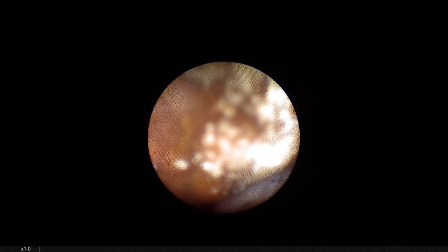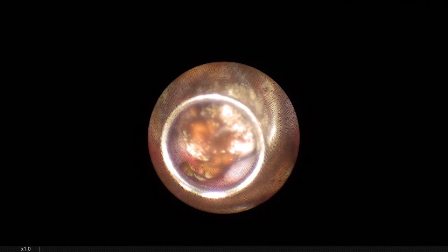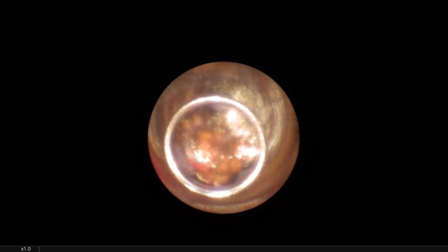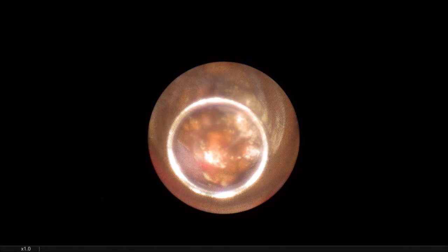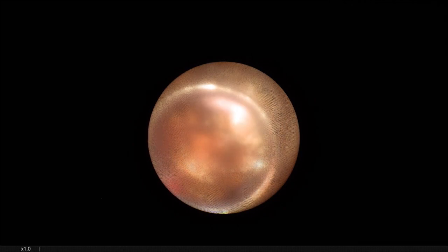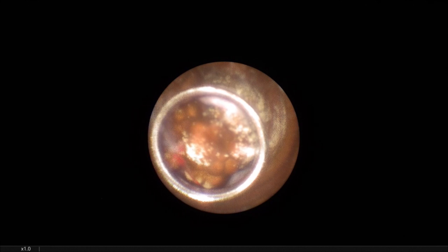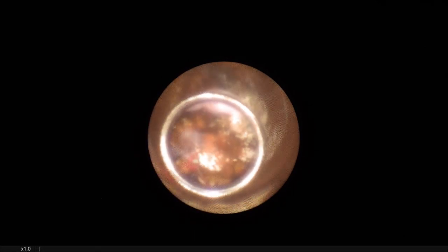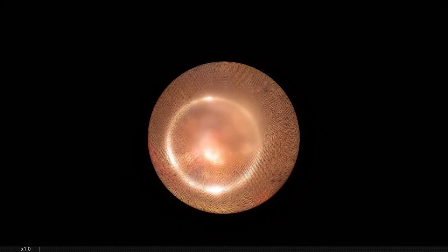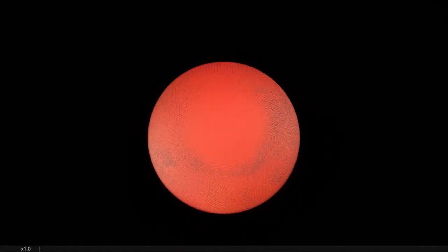Laser? No, cystoscope is not needed. Okay, we'll move it. It's a little higher, 10 centimeters higher. Okay, initial setting is 5 hertz and 800 millijoules. It's okay. The foot pedal, I need the foot pedal here.